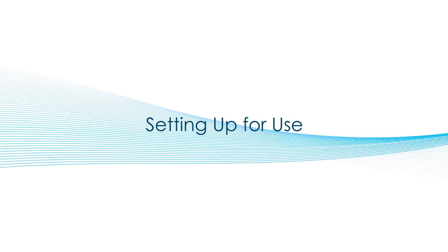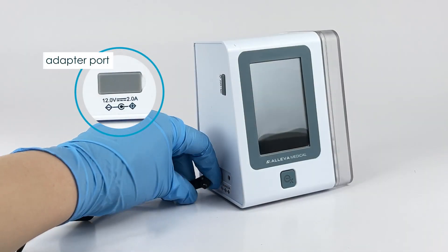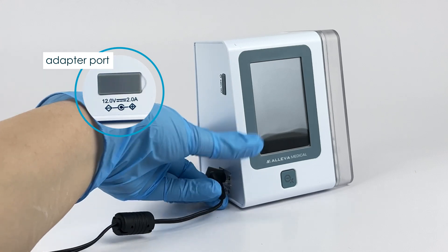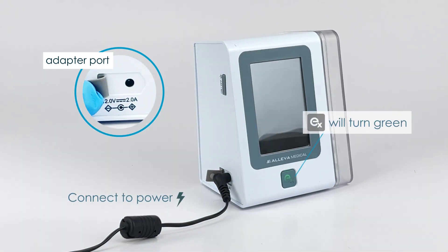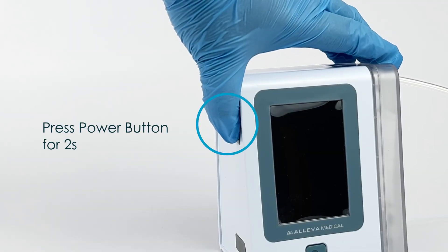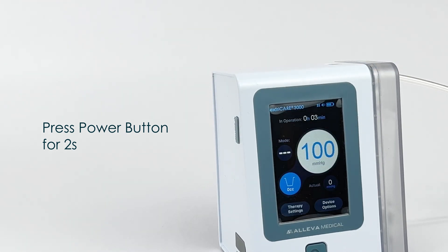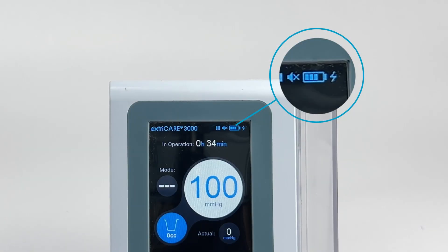Setting up for use. If the battery is low, please charge the ExtraCare 3000 by connecting the power supply to the unit. The adapter port is found on the side of the device. Open the soft cover and insert the power supply to the unit. If successful, the ExtraCare button on the front of the unit will start to flash in green. To turn on the device, press down the power button on the side of the device for 2 seconds. After the 2 seconds, you may hear a beep and the initialization screen will appear. When the device is charging, you may also notice the charging battery sign on the top of the LCD screen.